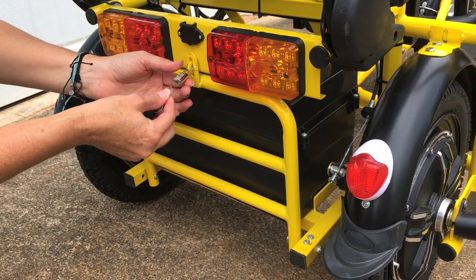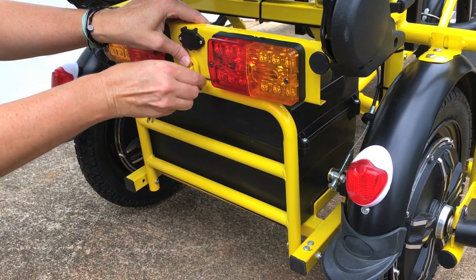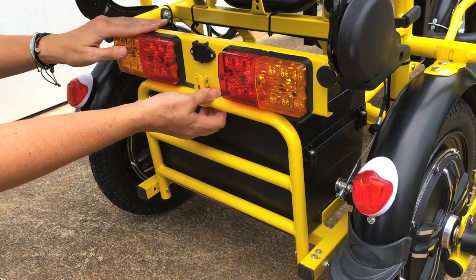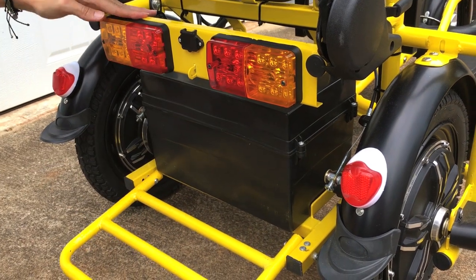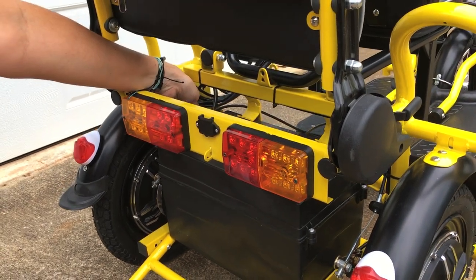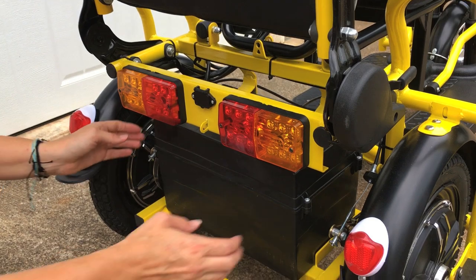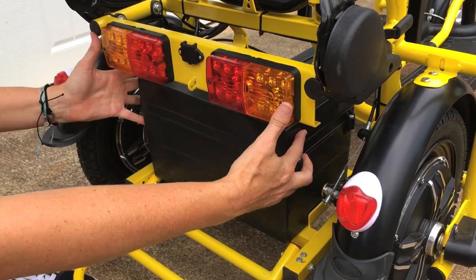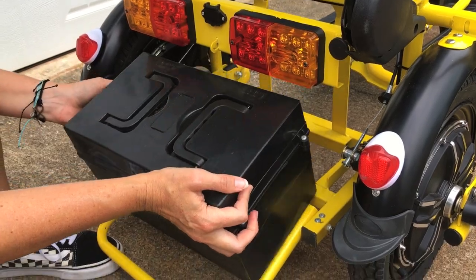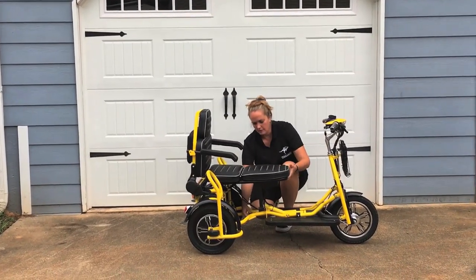To remove your battery, undo the lock. Pull down on the tailgate, reach in and undo the cable connecting your battery, and then you can just slide your battery box out. The pin is located underneath the seat, right here.